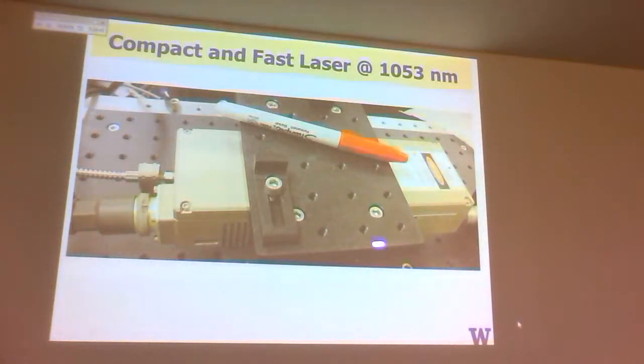The images I'll show you were made with this laser. It comes from Laser Export, which is a Russian company. We bought it for about $22,000, $23,000. You can now buy it for $15,000. It's 1053, so it's diode-pumped neodymium. I think it's not YAG. So what is it? YLF? What's the other garnet? Yeah, right. It's at 1053.